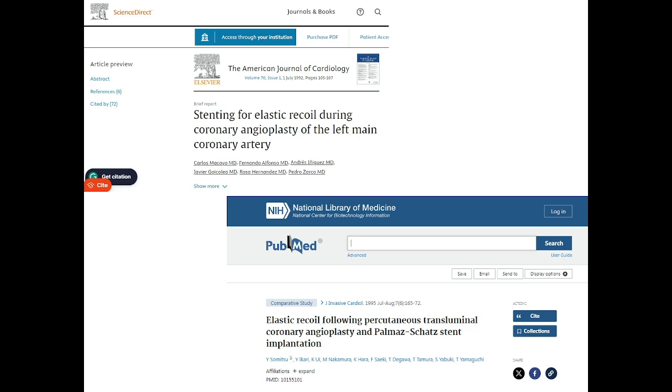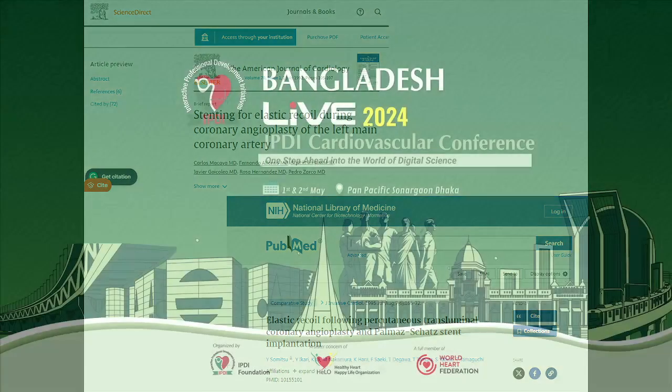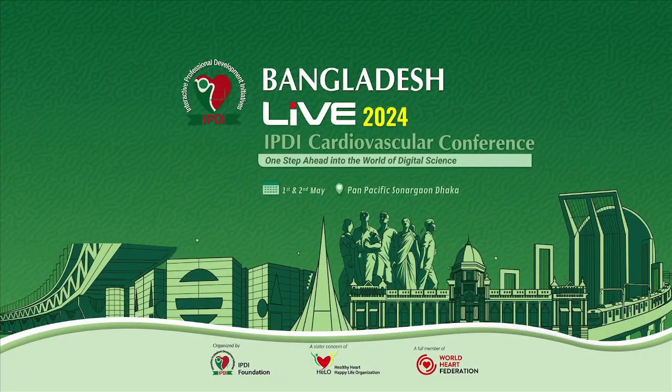Thank you, sir. You should think about elastic recoil of this segment. Another thing, IVUS would help us, but we have no IVUS at our center. This is the main message.